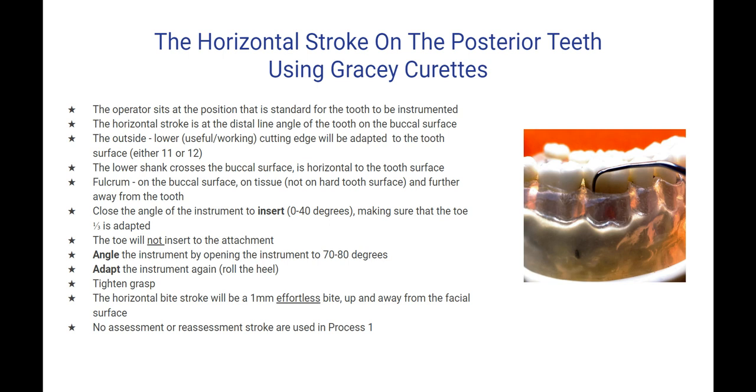The fulcrum is on the buccal surface on tissue, not on hard tooth surface, and further away from the tooth. So again, the fulcrum is now going to be on tissue and further away than you have been used to.